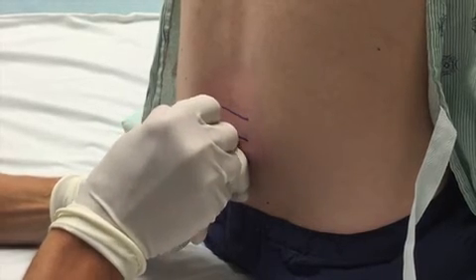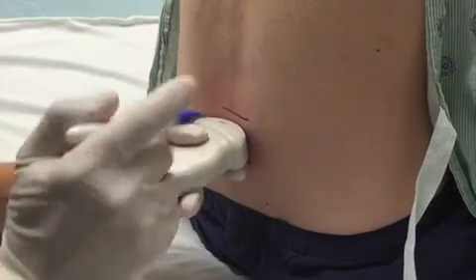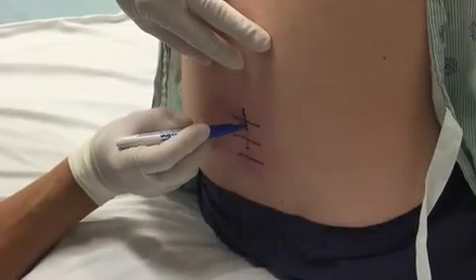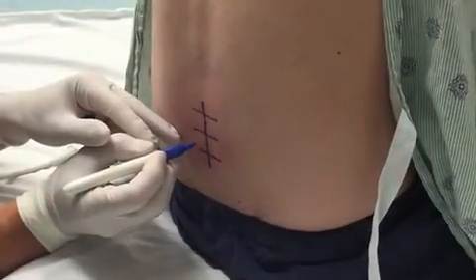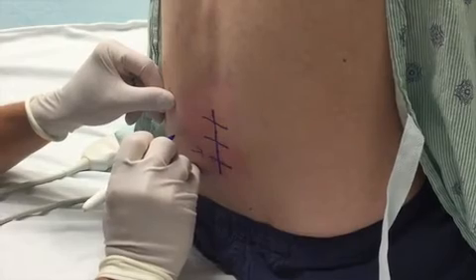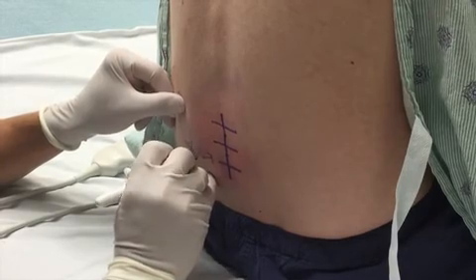In a similar fashion to the parasagittal view, mark the middle of the transducer with the spinous process centered in the middle of the ultrasound screen. Do this for several levels. Then simply connect the dots. You now have the interspaces marked as horizontal lines. The vertical line represents the midline of the spinous column. I have labeled L5-S1 here.